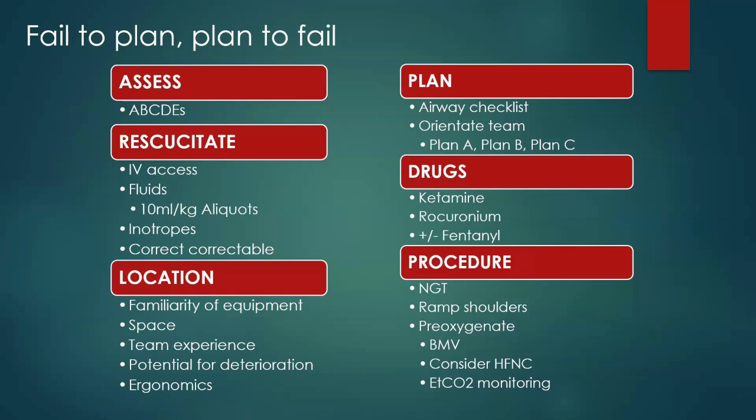So the first thing they say is you're going to be assessing your patients. So you're going to be doing your ABCDEs. And with this assessing, if you have the time as well, do your LEMON and your BOOTS and your MOODS. Look for and predict any difficulties in your airway so that you can essentially plan for it and make sure that your team is aware of what's going on.